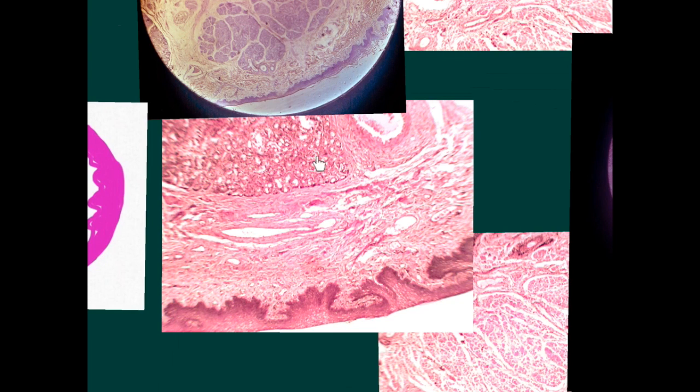Take care that sometimes the glands are not properly stained, so you should carefully examine the section to find out that they are pale blue glands, vacuolated, and present towards the mucous membrane side. And also, you will notice the absence of the hair follicles at the margin and the typical U-shaped structure.